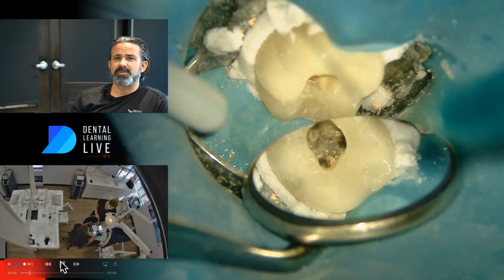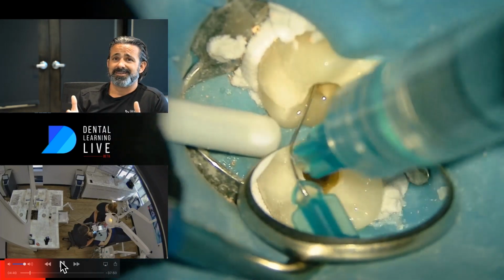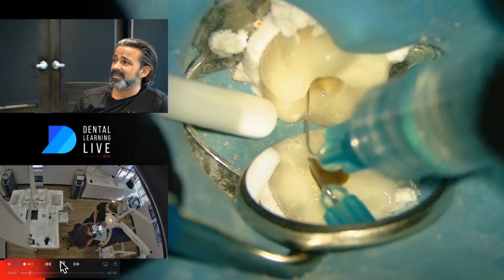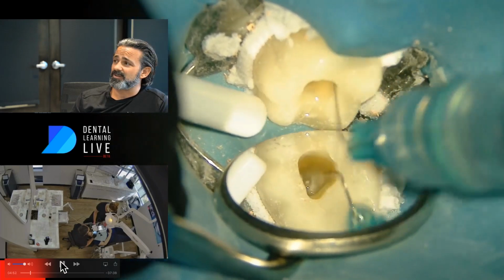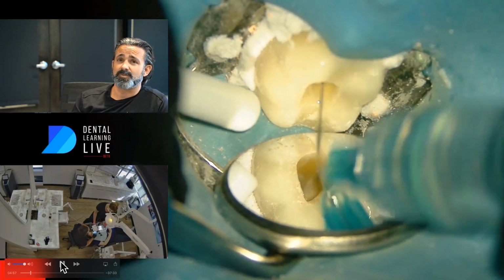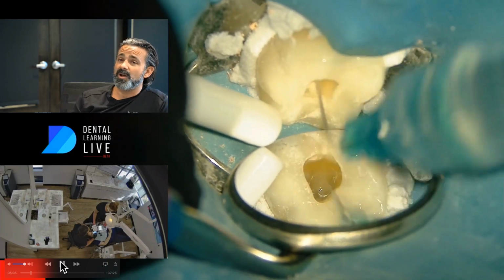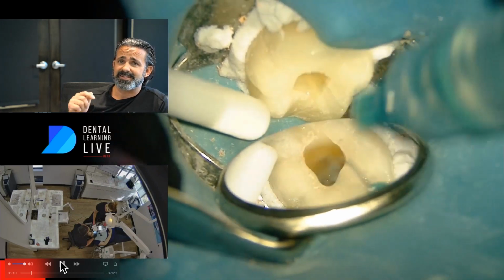One of the problems with retreatments that we all have is as I start putting pressure on that, I'm just smearing the gutta percha and/or sealer deeper into any sort of aberrant anatomy inside that canal, inside that root system. So I favor then chloroform, and that's what I'm doing right now. One of the difficult things with chloroform is it doesn't have a really good surfactant property, so it's hard to get it down on top of the gutta percha, and so I always agitate the chloroform and then just keep dripping it in as I'm agitating with my needle.